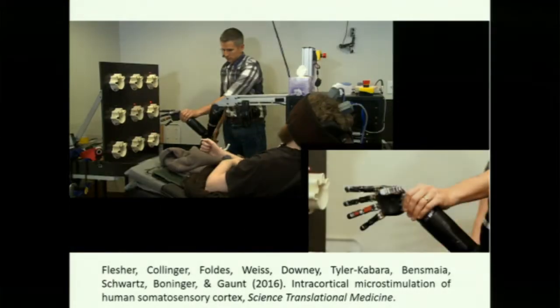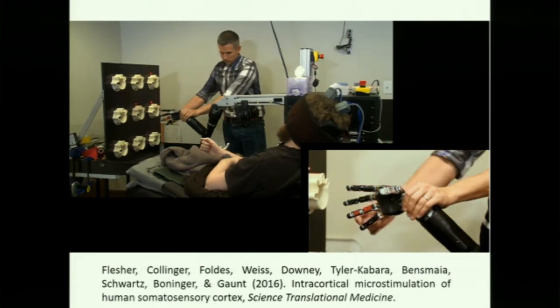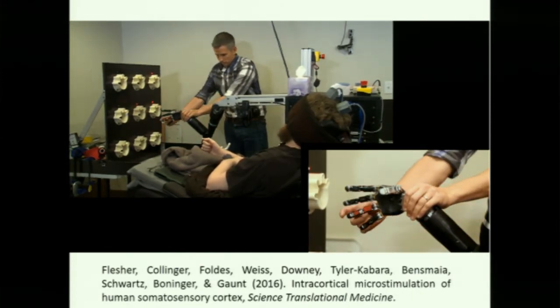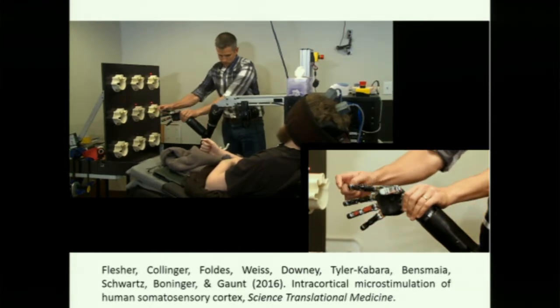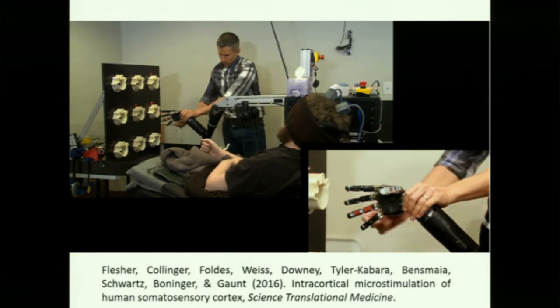So here, this is just showing that when you do this mapping between electrodes and sensors properly, the patient, when you touch a finger, experiences it on that corresponding finger. And he gets it right every single time. And this is not shown in this video, but occasionally Rob would do 2 fingers at a time to see if the patient would report that, and unbeknownst to the patient, he often got it, like, hey, that felt like my index and my ring finger.